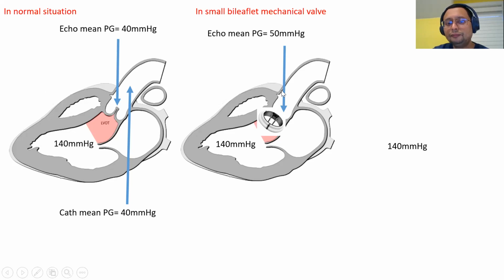However, when you measure distally using a catheter in the aorta, the velocity on the lateral side that is slower has now converged. Therefore, the pressure has recovered. So if you measure 90 millimeter mercury here, it has recovered to 100. So therefore, with catheter, you measure 40 millimeter mercury. Okay, so this is what I mean by pressure recovery.